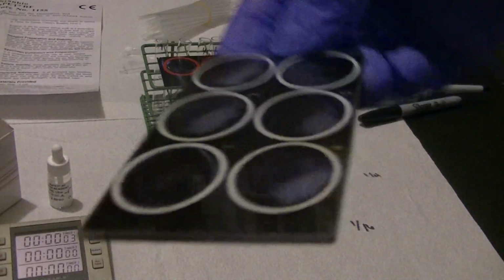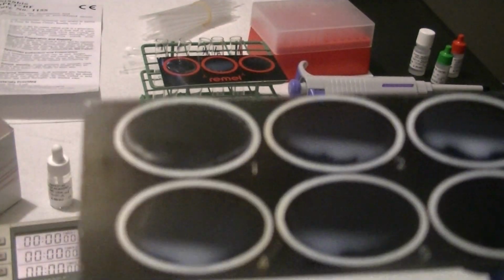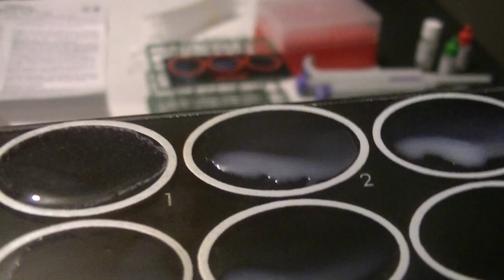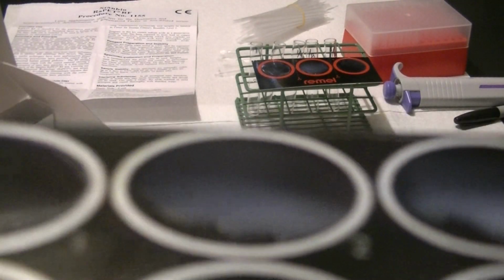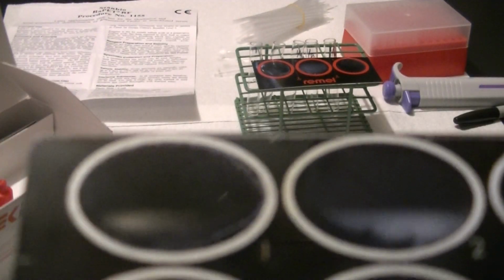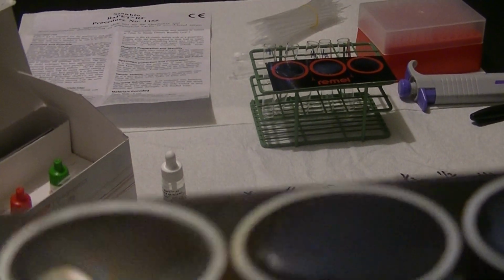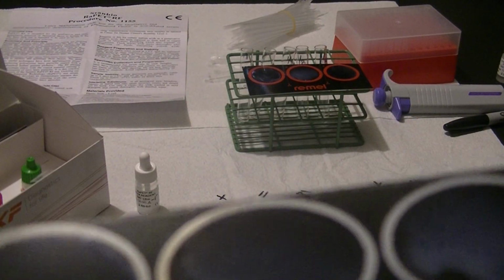Okay, my timer is about to go off, so I'm going to start showing you. The undiluted sample is still positive. You can see the white clumps. However, the 1 to 2 is very, very weakly positive. It may be really hard to see that on this camera. Let me see if I can get it focused good enough for you guys to see. There are teeny tiny, very visible clumps there, so I would call it positive.